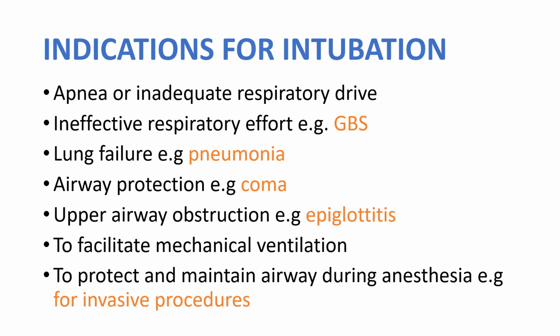Let's start by reviewing indications for intubation. The first one is apnea or inadequate respiratory drive. The second one is ineffective respiratory effort, for example, in Guillain-Barré syndrome, lung failure in pneumonia, airway protection for patients in coma, upper airway obstruction, for example, in epiglottitis, to facilitate mechanical ventilation, and also to protect and maintain airway during anesthesia for invasive procedures.